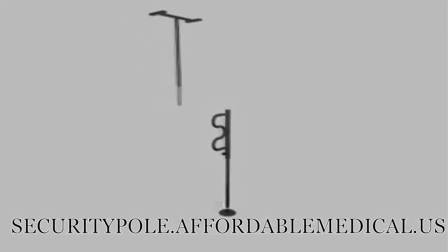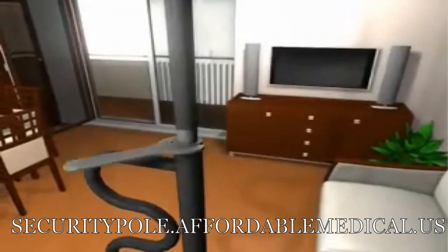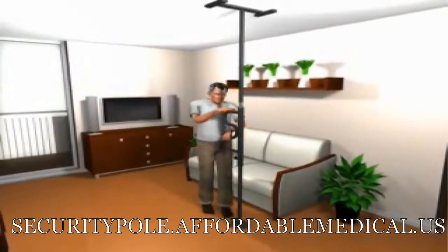Dad is 6'4", 225 pounds and geriatric. Getting out of his favorite chair was a huge challenge, and then watching him transfer to his scooter was a fingernail biter.